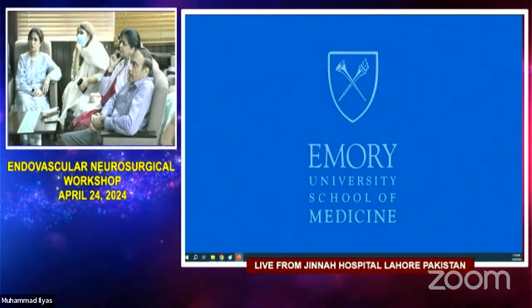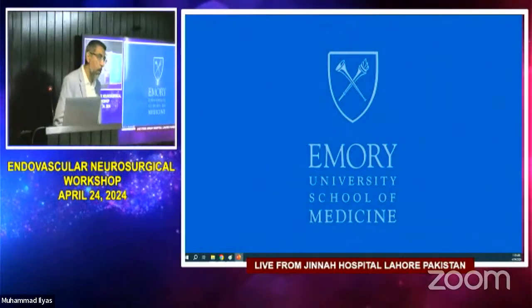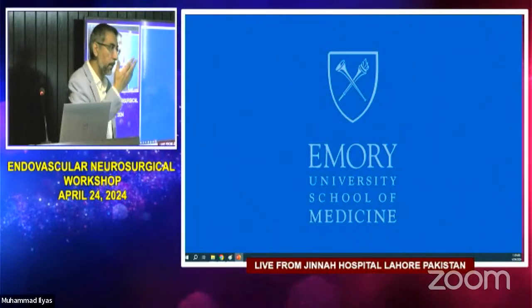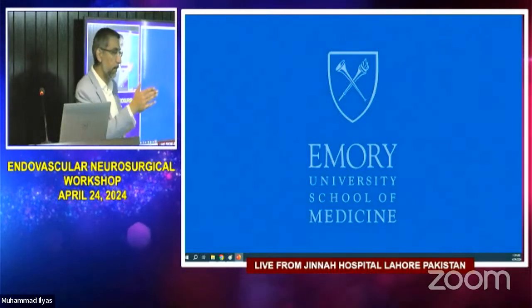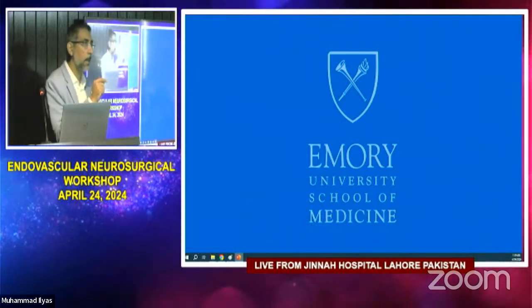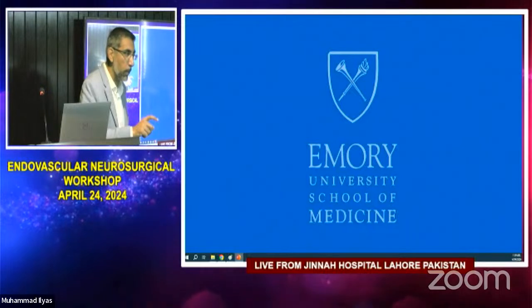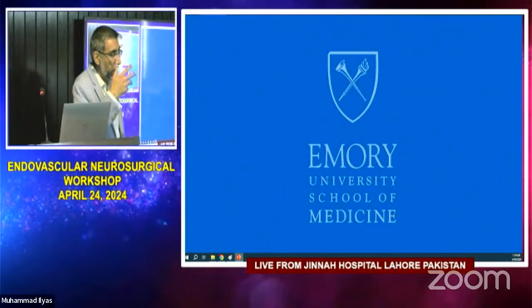At the moment, I think that's a great question. I can tell you, artificial intelligence has already come into this space, and I'll tell you how. Dr. Saab here talked about CT perfusion, right? Back when CT perfusion and thrombectomy became commonplace in 2013-14, I'm just giving you a little bit of background so you'll see how AI has revolutionized stroke care at least. It's even doing that here in Pakistan, and ICVD has it in Karachi. So patients would come in with a stroke, we'd get a CT, CTA, and CT perfusion. Then the computer would process the CT perfusion.